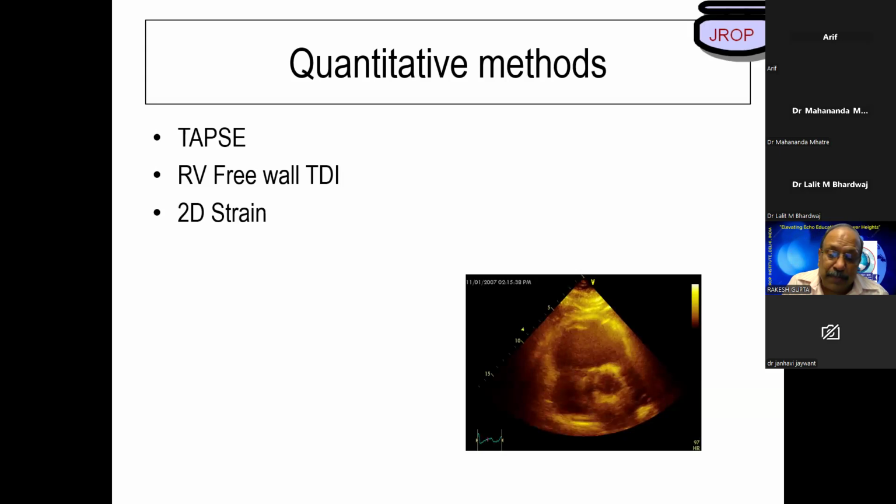Yeah, that could be a possible factor. Normally, there is a septal to posterior wall delay of less than 130 milliseconds. The septum and posterior wall will not contract at the same time. If the order reverses, that could be because of LBB or poor LV systolic function.